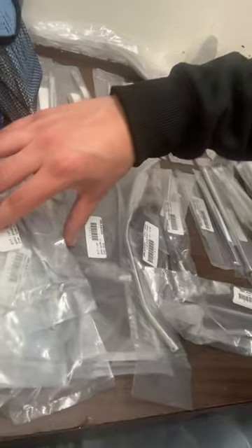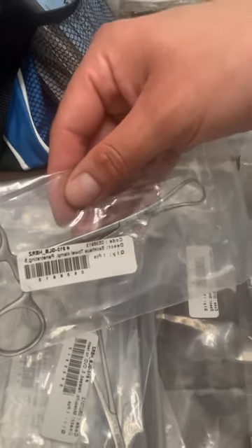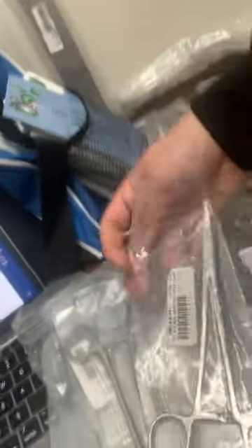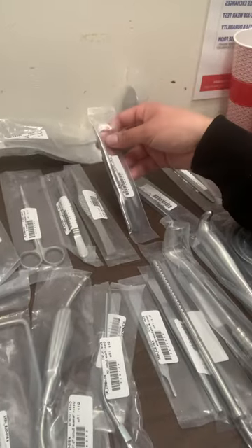A lot of these that are right here are basically different sizes. For instance, this is called a Backhaus towel clamp. Over here we have tonsils. There's a lot of sizes — I noticed there's a lot of sizes in the same instruments. There's some big instruments, some small skinny and thin ones.